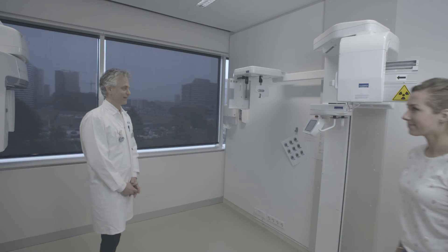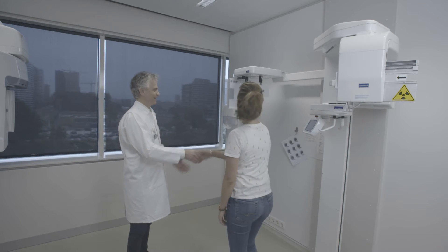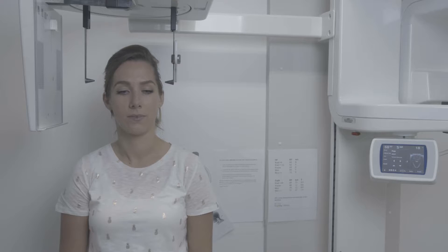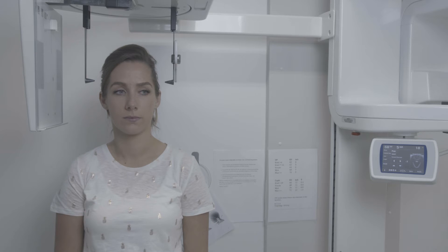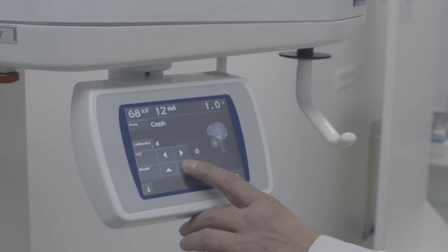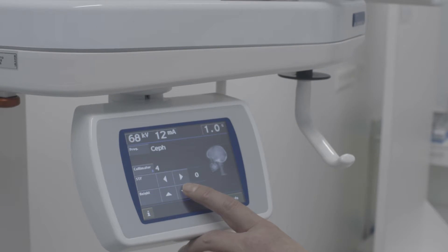We start with positioning the patient correctly in the cephalostat. We place the patient between the ear posts. The patient is asked to stand up straight with shoulders relaxed. Now we adjust the vertical position of the cephalostat.